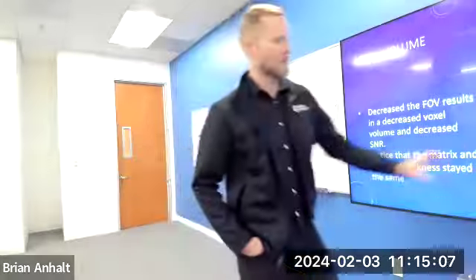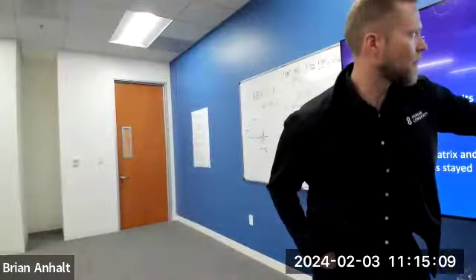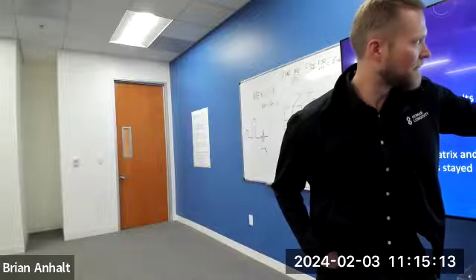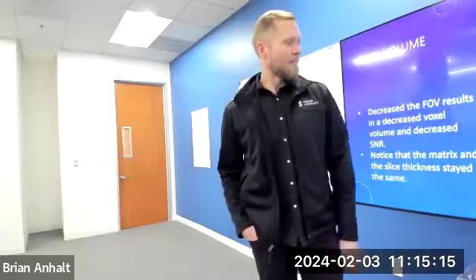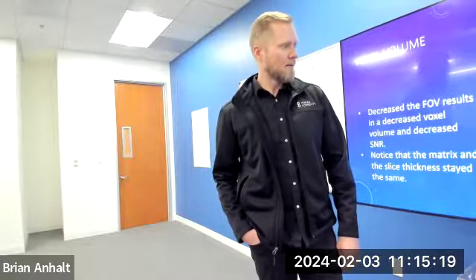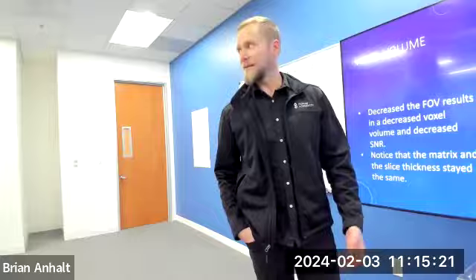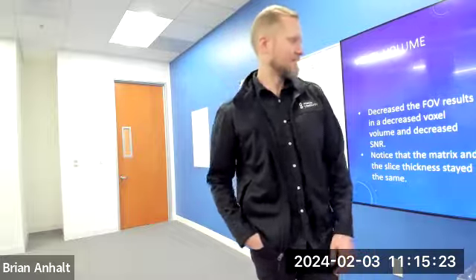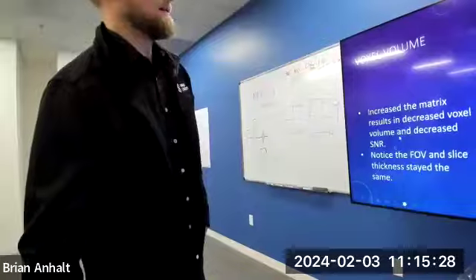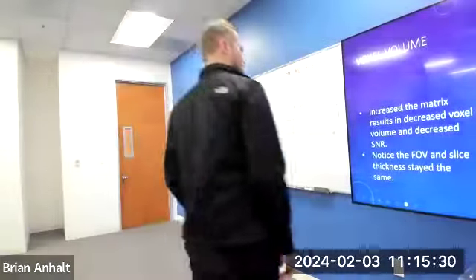Because if you look at this piece right here, it will fit into 1/4 of this, right? Field of view has a large impact on SNR then, right? And then matrix.